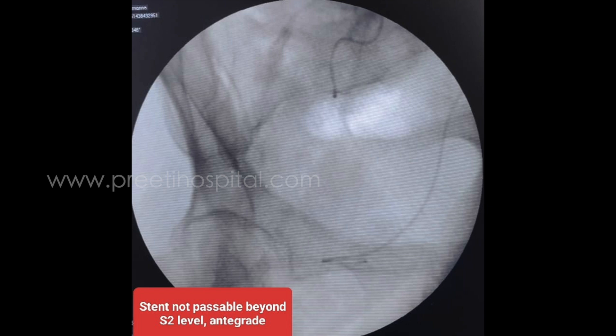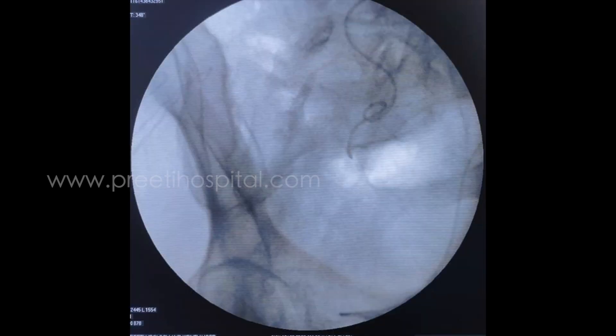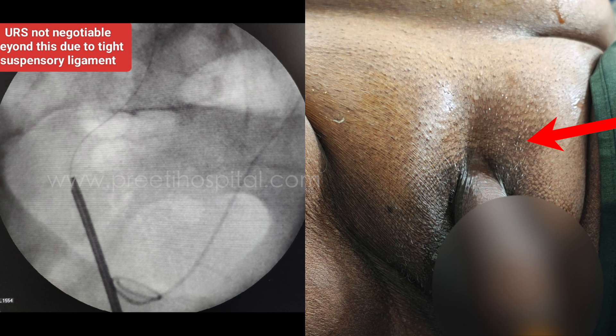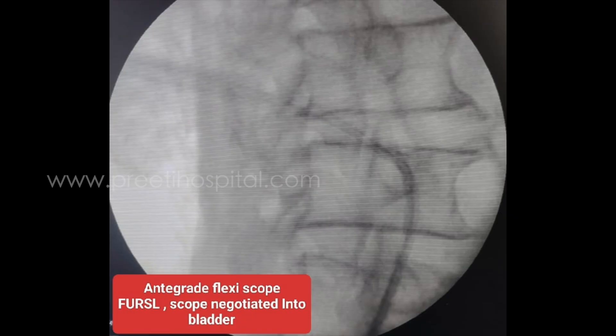At the end of the procedure, the stent could not be passed beyond the S2 level, from anterograde as well as retrograde. At the same level, the ureteroscope also could not be negotiated beyond this point due to a tight suspensory ligament. Therefore, anterograde flexible ureteroscopy was performed.